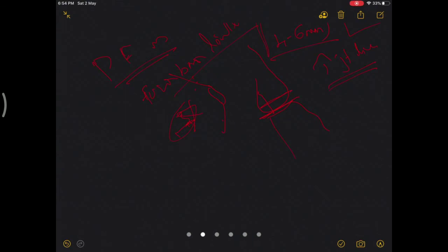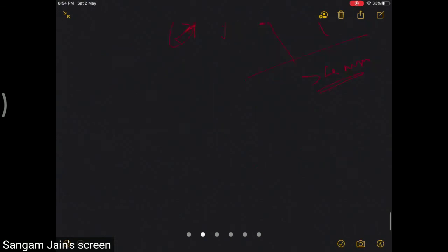And if it is too much, if you have elevated the joint line more than around 4 mm, there are issues like patellar subluxation, patellar abnormal tilting, and dislocations. Okay, to make it constrained in the trochlea, you may use a thicker button, and that will overstuff, which is there in the models with PS.